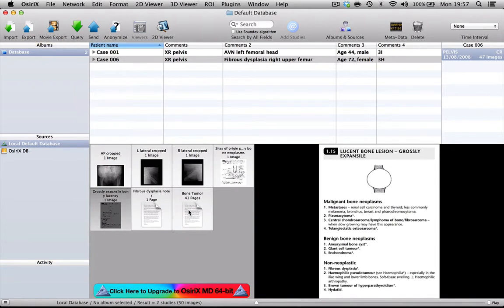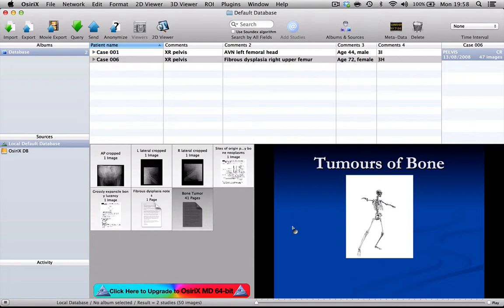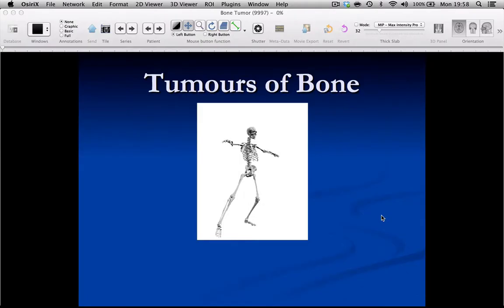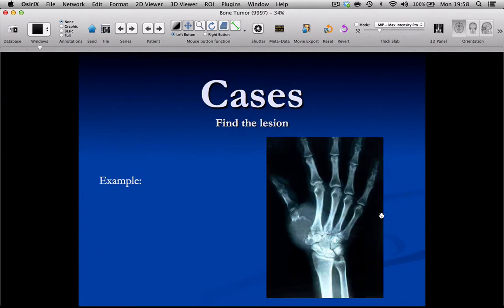And the other thing that you can do, if you want to, is if you change a PowerPoint presentation into a PDF, you can import that so that here we've got a nice presentation that is telling us about bone tumours.